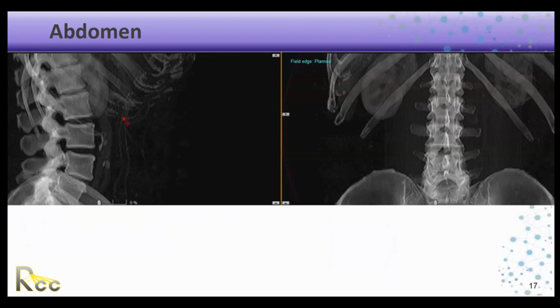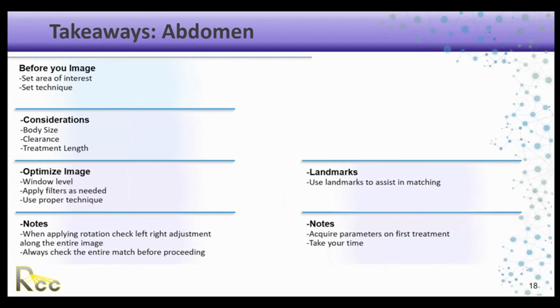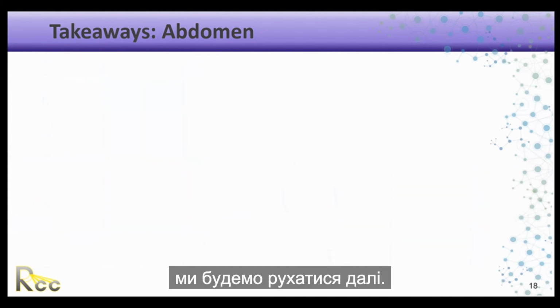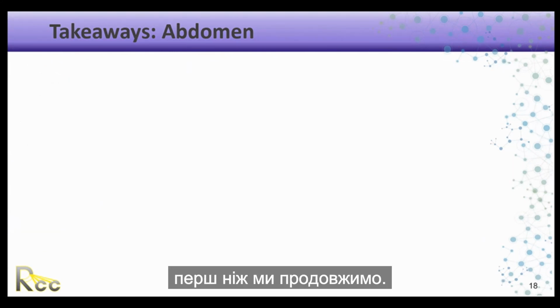So here are some takeaway notes for abdomen. I'm going to leave this up for a minute and then we'll move forward. Okay. Any final questions about what we discussed in the abdomen before we move forward?